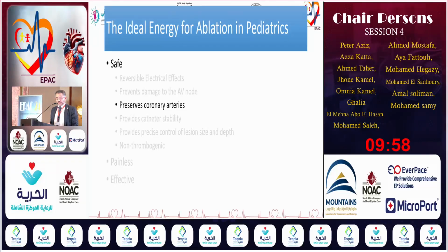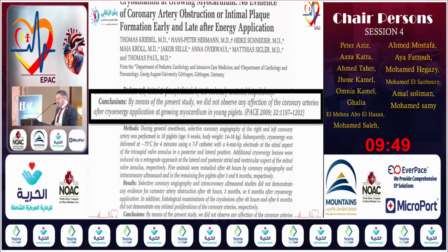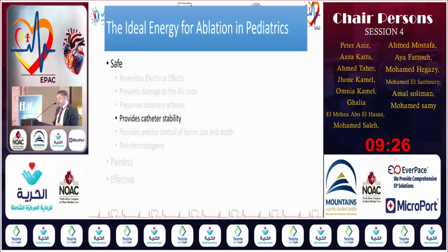The other reason why it is safe is because we have evidence that the collateral damage with cryo is minimal. Although this comes from an animal study, when it is carefully studied, the collateral damage of cryoablation, the remote lesion formation, is very minimal, and all coronaries are preserved, probably because of the heat sink mechanism in the coronaries that increases the temperature quickly to prevent any damage in the coronaries.